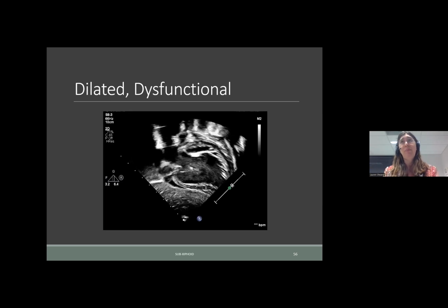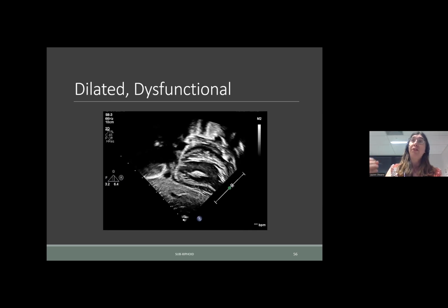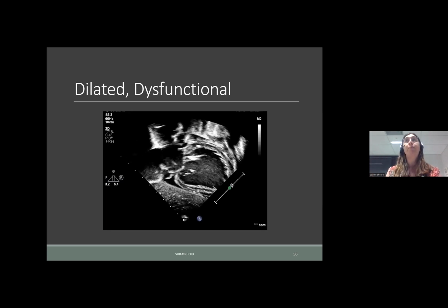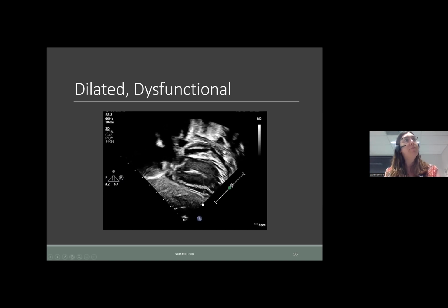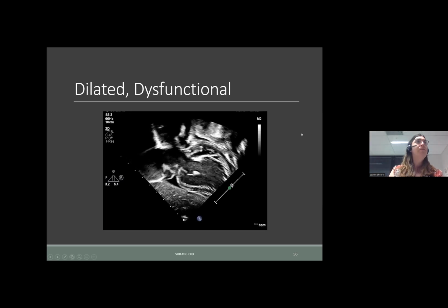Early after birth, those pulmonary vessels are relatively stiff and the pressure remains high enough to perfuse the myocardium. But in the months after birth, as it becomes easier and easier for the blood to move through the lungs, the pressure drops and the left main territory becomes progressively ischemic. And so we have a dilated heart with a regional wall motion abnormality. We actually have a small amount of effusion here, but this is probably not clinically significant.